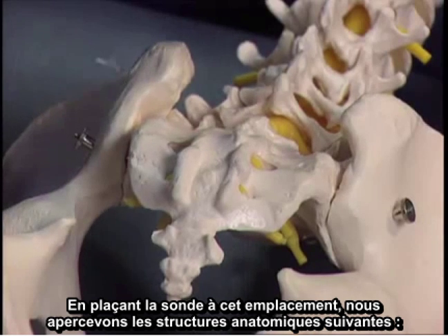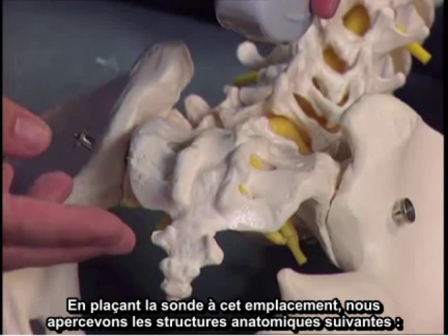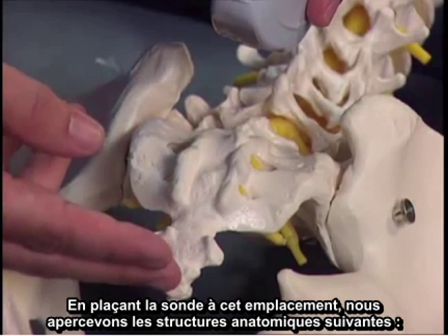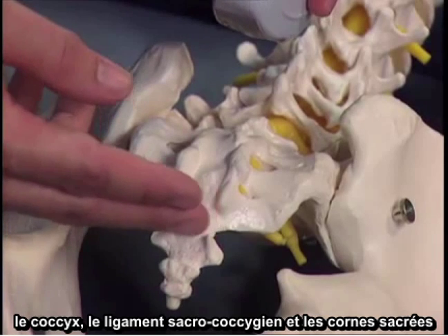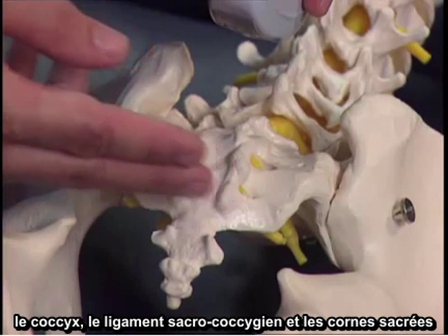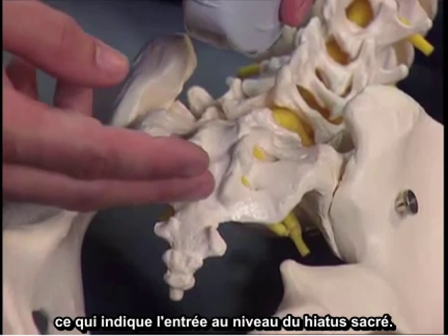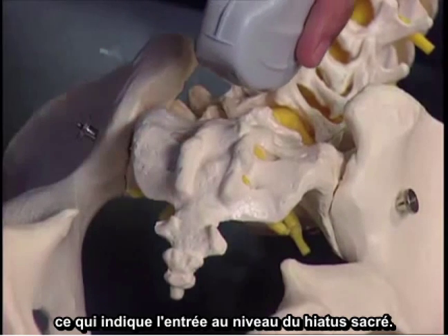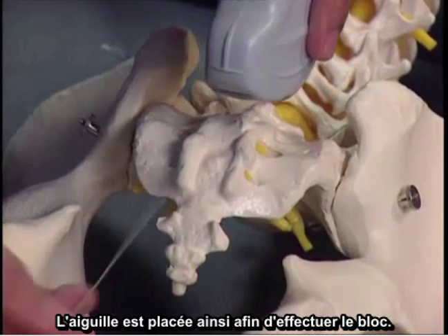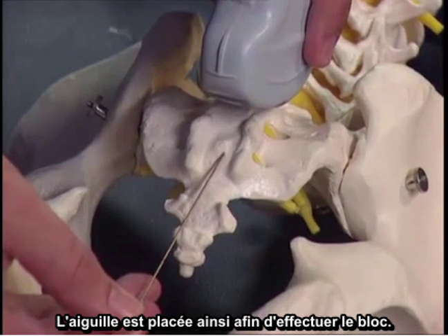With the probe in this location, we can see the following anatomic structures: the coccyx, the sacrococcygeal ligament, and the sacral cornue. This indicates the entry at the sacral hiatus. The needle is placed thusly, performing the block.